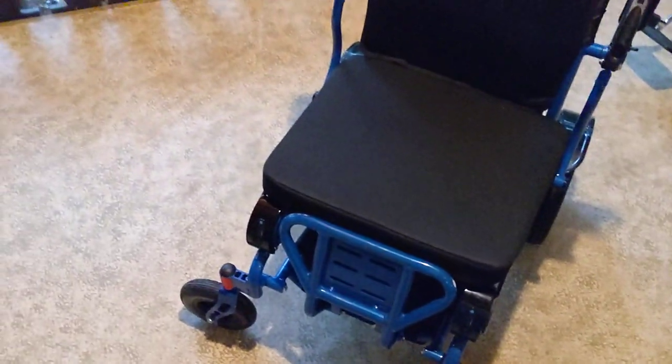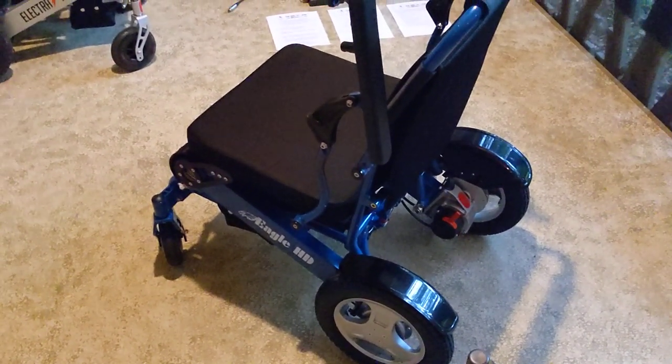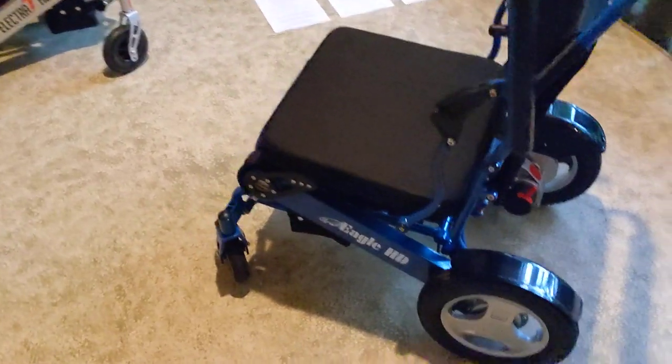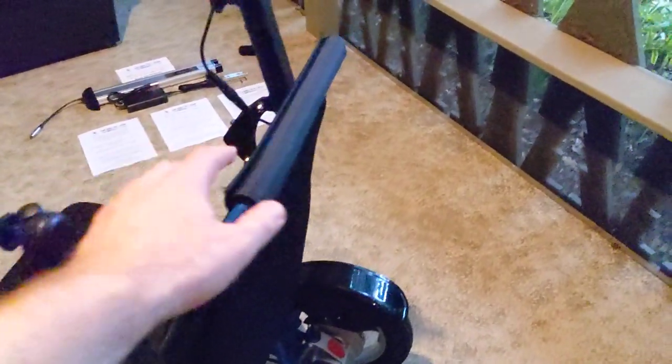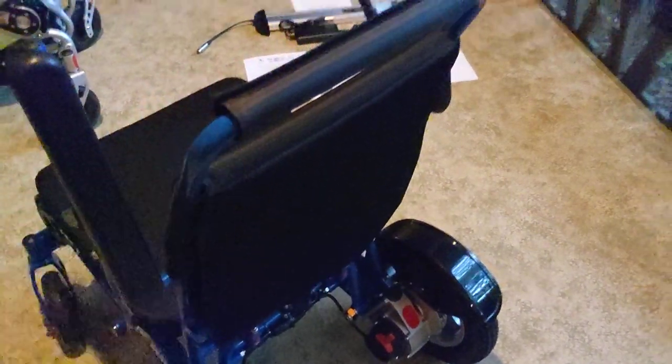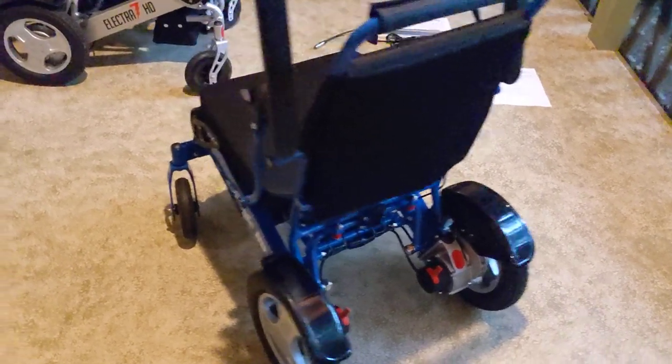I'm just using one hand throughout this video — to me, it's a very simple chair to work with. If you are a caregiver, it's a simple chair. And if you're a chair user, it's a simple chair. We have people who have started their own YouTube channels demonstrating the utility of how simple this chair is to actually use.